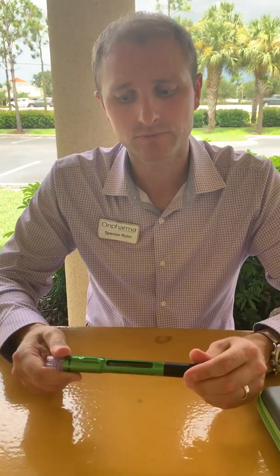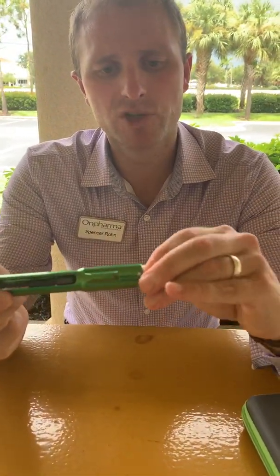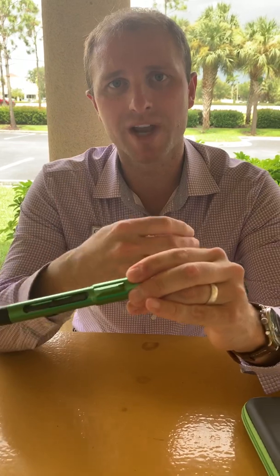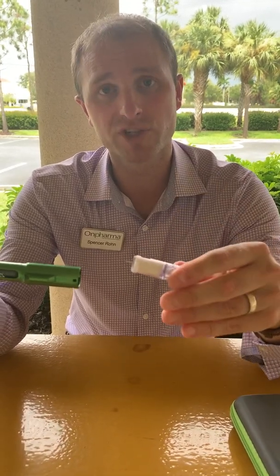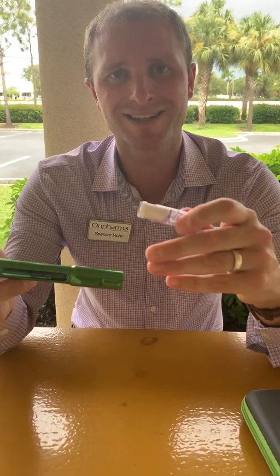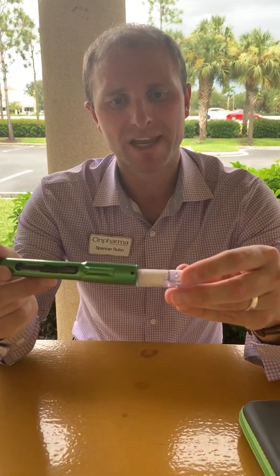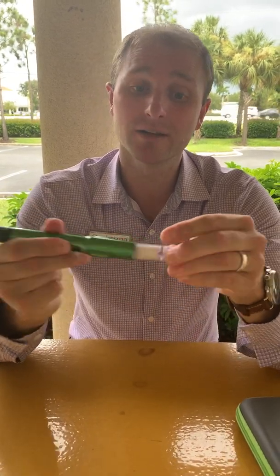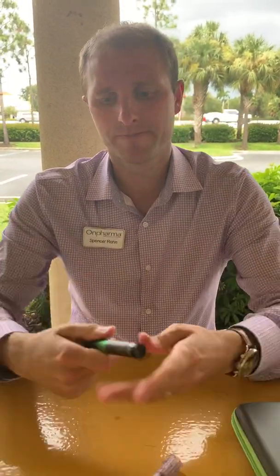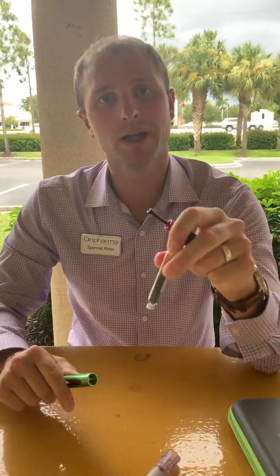Now, can we take a closer look at that cartridge connector piece you just mentioned? Yeah, so whatever you put into the local has got to come out, right? You've got to make room for that sodium bicarbonate that you're injecting into the local. So some of that excess local anesthetic is then stored in the sterile chamber. You could think of it as like a sponge. So after 20 injections, you're replacing the cartridge connector and you're replacing the sodium bicarbonate.